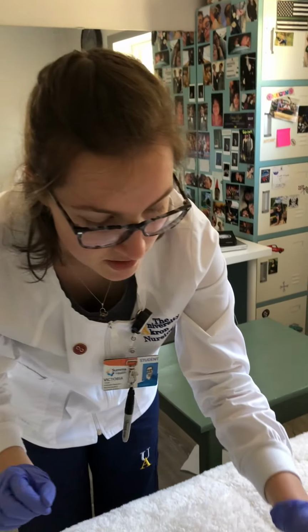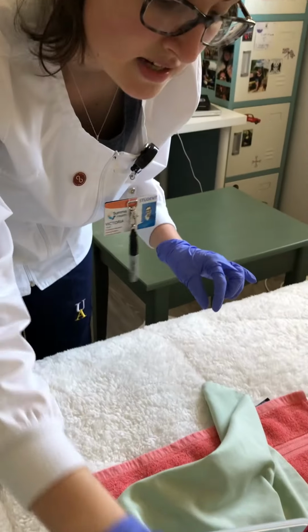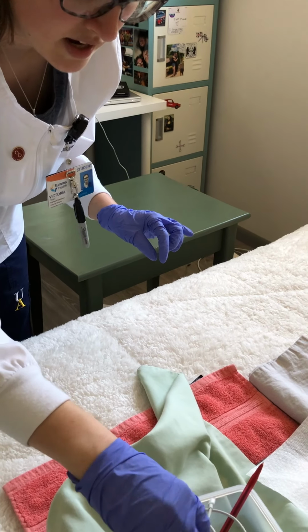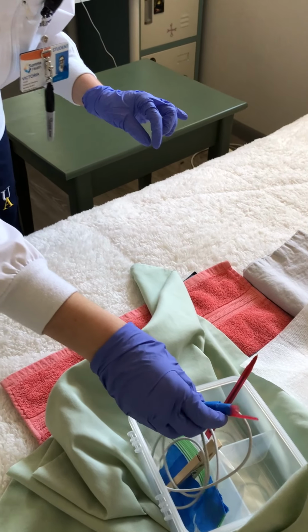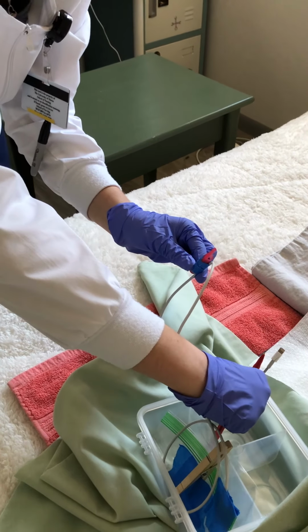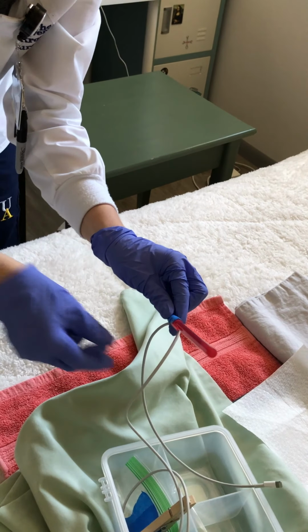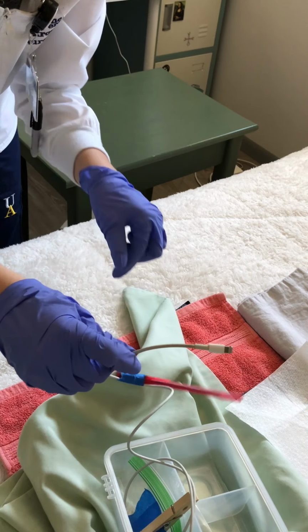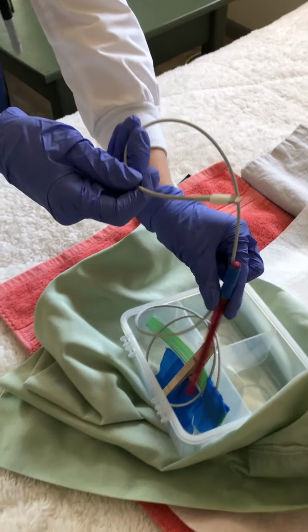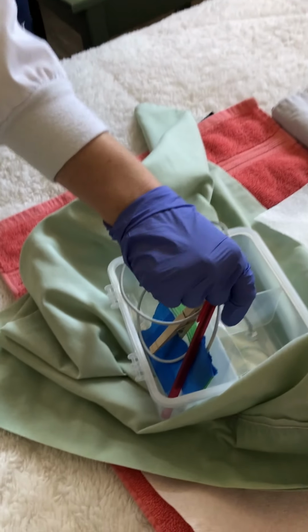And then I am going to take the catheter tubing with my sterile dominant hand, okay? And I'm just going to go ahead and take that syringe with sterile water and insert it into the hub, okay? And then I want to go ahead and take the tip of the catheter and insert it into the lubricant.